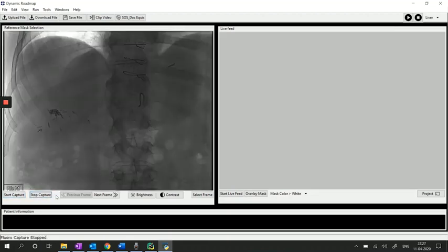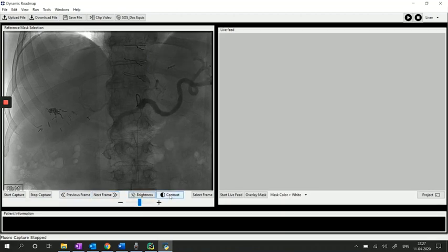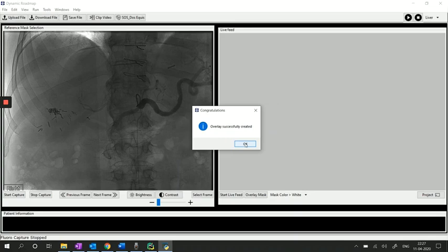The software then cuts the video into successive frames which you can navigate back and forth to select the best frame. You can also toggle the brightness and contrast of the chosen frame and then hit the select frame button. Our software then processes the frames and creates an arterial roadmap from it.